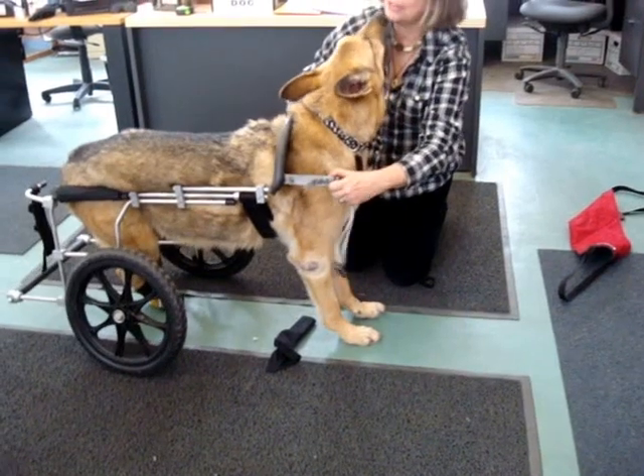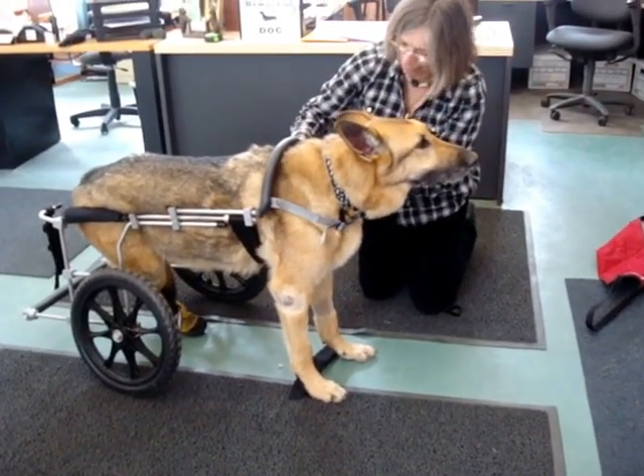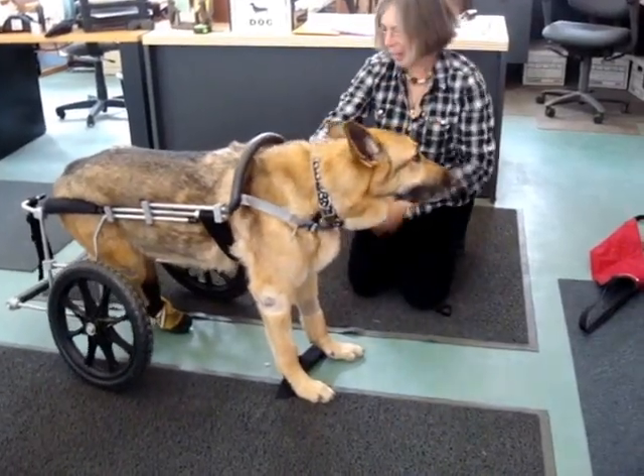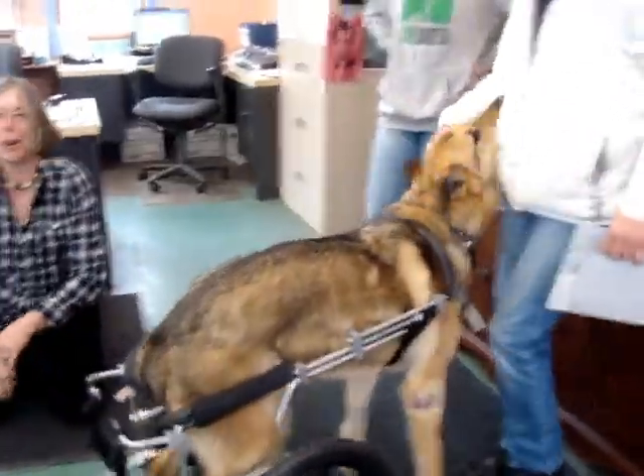Reattach the support strap to his yoke so that the yoke is floating over his shoulders, and then I lengthen it. Good boy, thank you. Now you can go. Good job. Good boy. There you go.